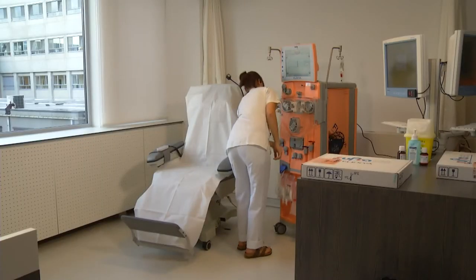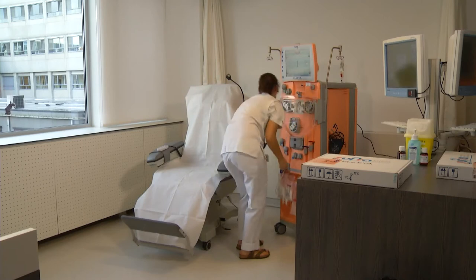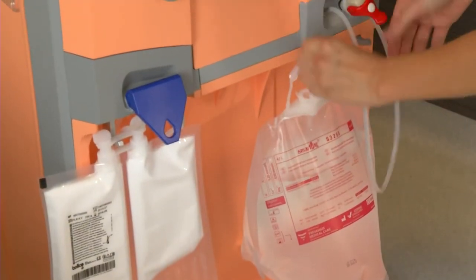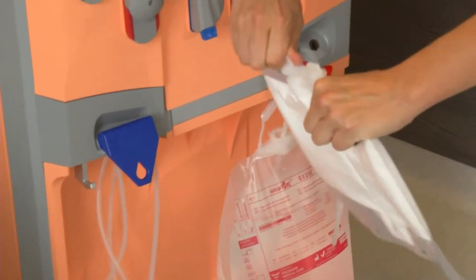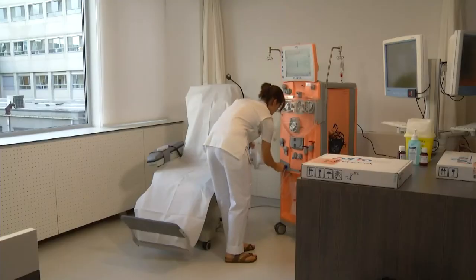We attach the acid concentrate and bicarbonate to the unit. We make a stable dialysate conductivity of 14 millisiemens per centimeter and bicarbonate of 3 millisiemens per centimeter. Building the extracorporeal circuit can happen after the dialysate is composed or even simultaneously.